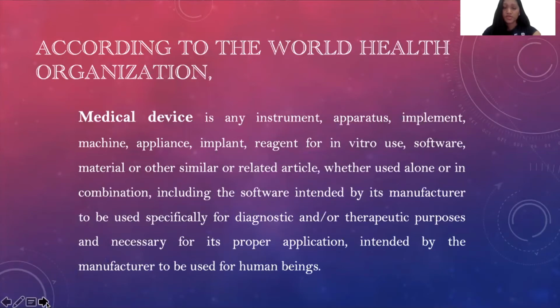According to the World Health Organization, a medical device is any instrument, apparatus, implement, machine, appliance, implant, reagent for in vitro use, software, material, or other similar or related article, whether used alone or in combination, including the software intended by its manufacturer to be used specifically for diagnostic and/or therapeutic purposes, and necessary for its proper application, intended by the manufacturer to be used for human beings.